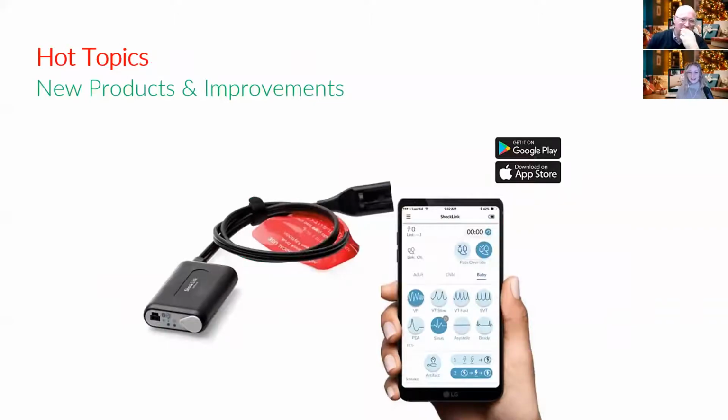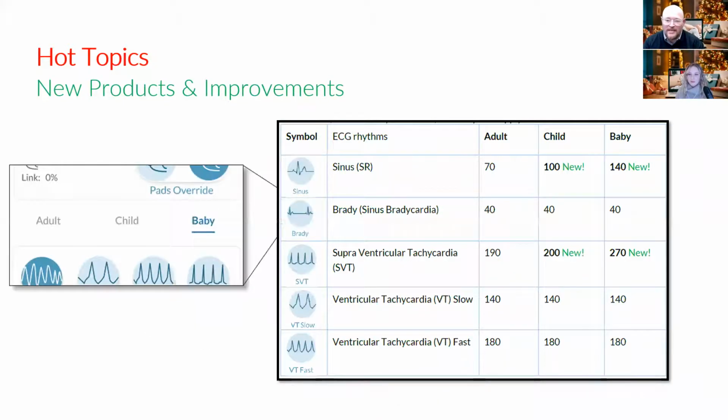All right, Shane, I'm going to hand it off to you for our last portion before we get into Client's Corner. Cool. So this is a big thing that I've always heard about ShockLink: there were no pediatric rhythms. Well, we have heard you, and now they are there.